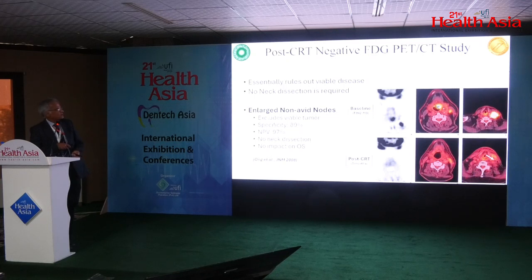This is a case of the post-CRT negative FDG PET-CT study, and it is generally a consensus that it essentially rules out the viable disease, and therefore in such cases no neck dissection is required.